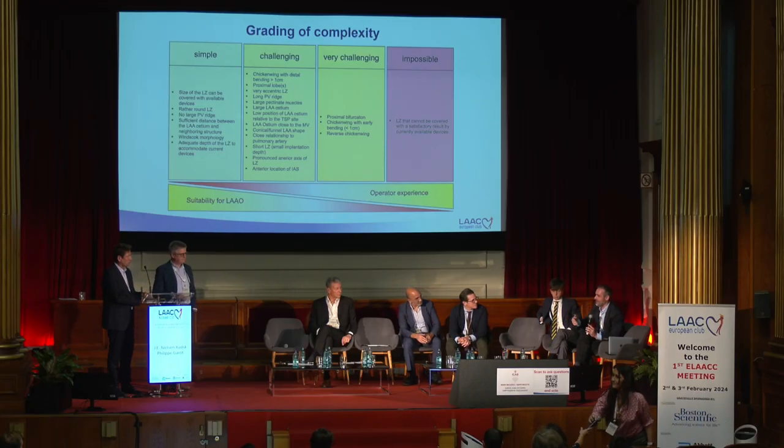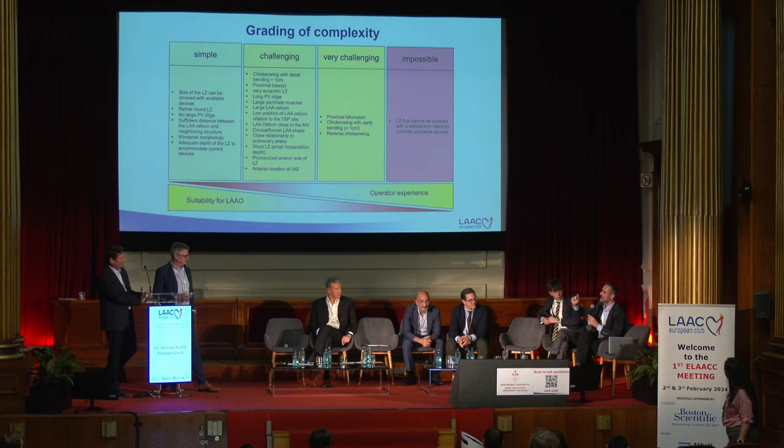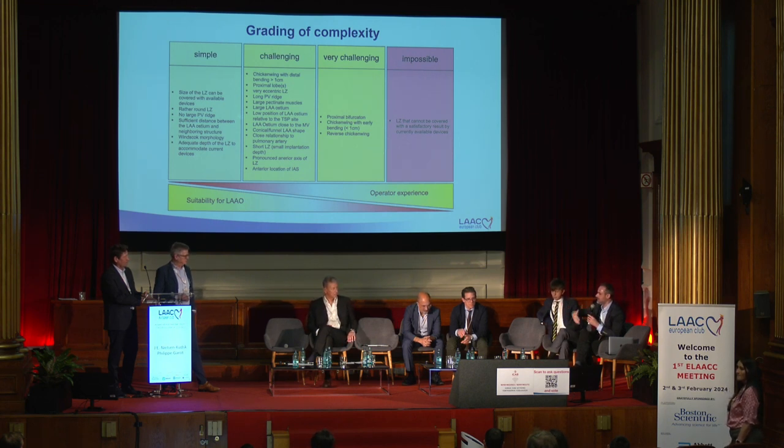I don't know if it's because I'm working with Laura, but I completely agree with her. To me, the most important factors are ostium, landing zone, and probably the last one, the functional, thrombus and contracted. The general appearance is nice to have, but in the end it doesn't affect. It's nice that it fills the LAA, but at the end, it's the ostium.